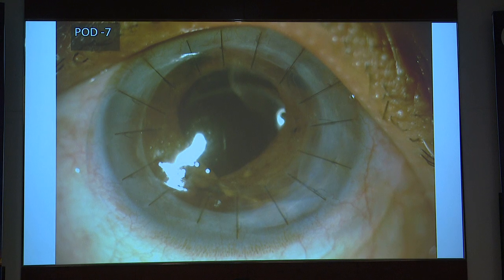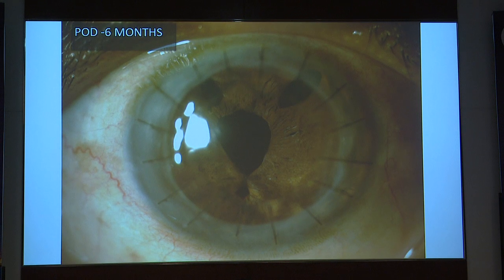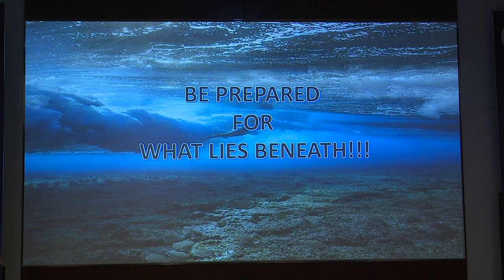So this is at day 7. Again, the pupil here is a little dilated. And this is at 6 months. Patient has unaided vision of 6 by 18 with sutures on right now. So to conclude, you need to always be ready with all your armamentarium because you don't know what lies beneath.